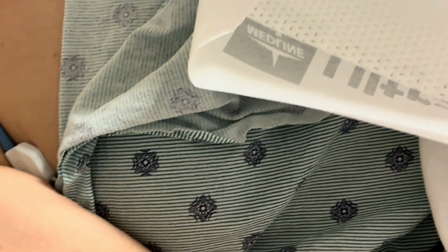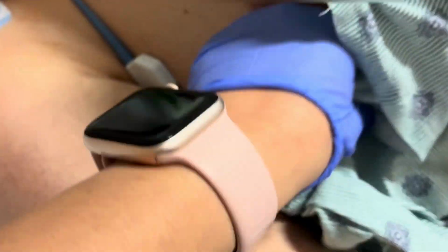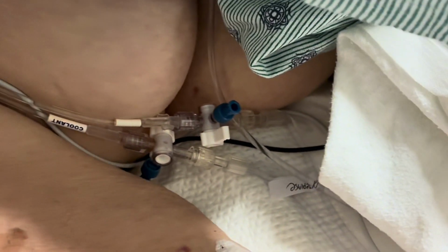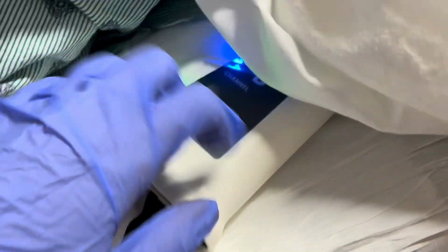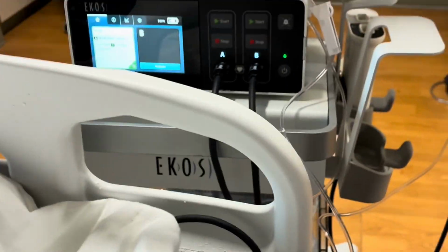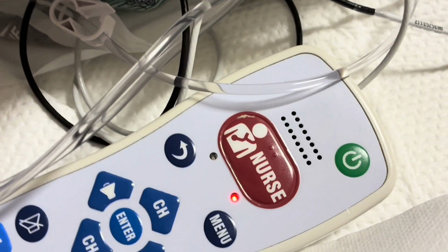And let me just show you here. So this is the actual catheter. As Asha is doing this, I will be doing this. That's your console over there, and we have this connector here.